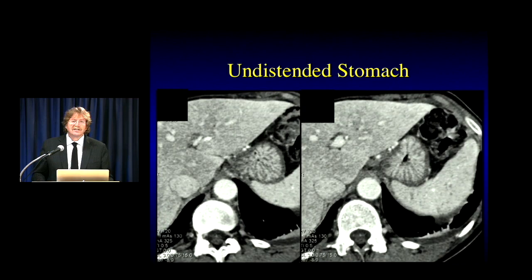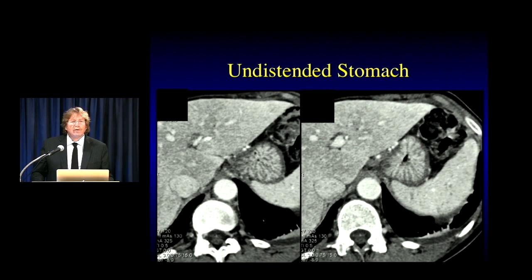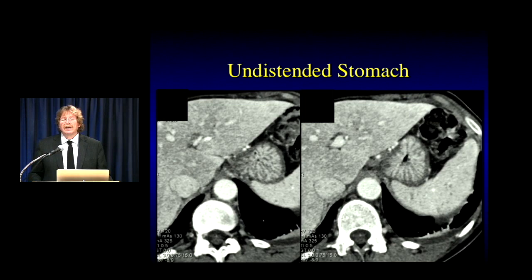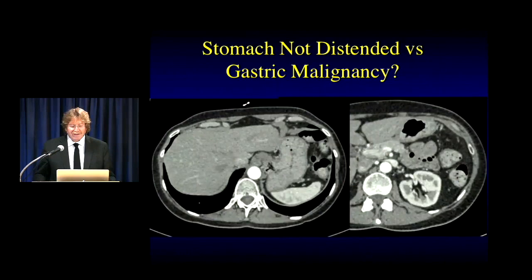But if I give you this case and ask what about the stomach — is that an undistended stomach, gastric infiltration by tumor, or gastritis? It was really normal, but you could not tell me that here. That's why when we do all of our cases, we always give water or positive contrast to distend the stomach. You get rid of all these pseudo-lesions, and your reports make sense.